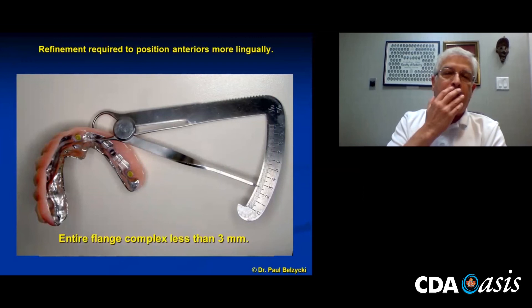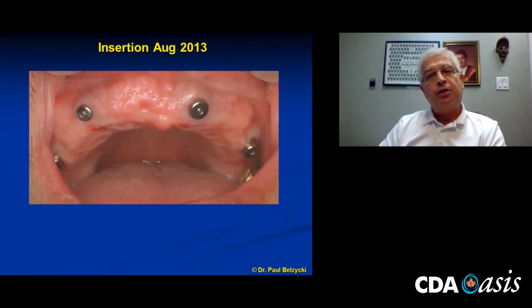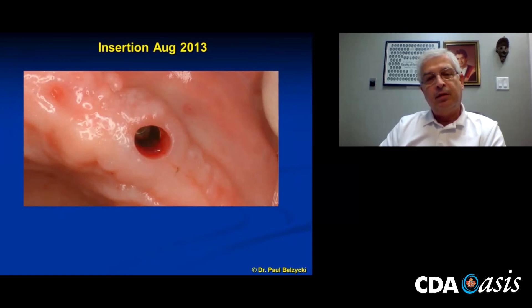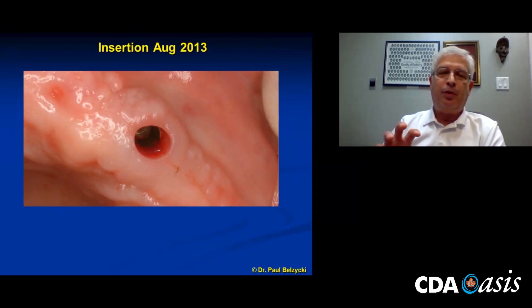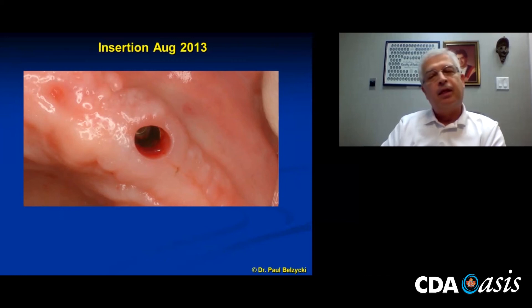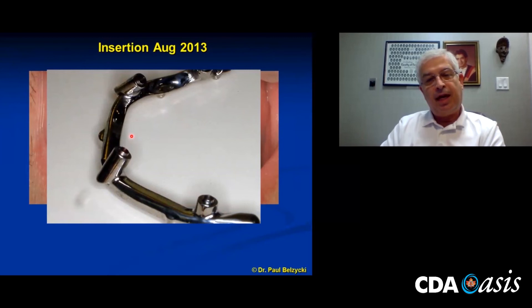The day of insertion was 2013. I had to give him some local — that's why it's bleeding a little bit; those are the puncture wounds. The tissue was quite nicely healed. The bar was tricky to get in — you couldn't put all four in at once. You had to insert the two going backwards into the anterior implants first, and once they touched, you could then swing the posterior implants into place. The angulation forces you to put the anterior segment in first and rotate it back onto the posterior implants.